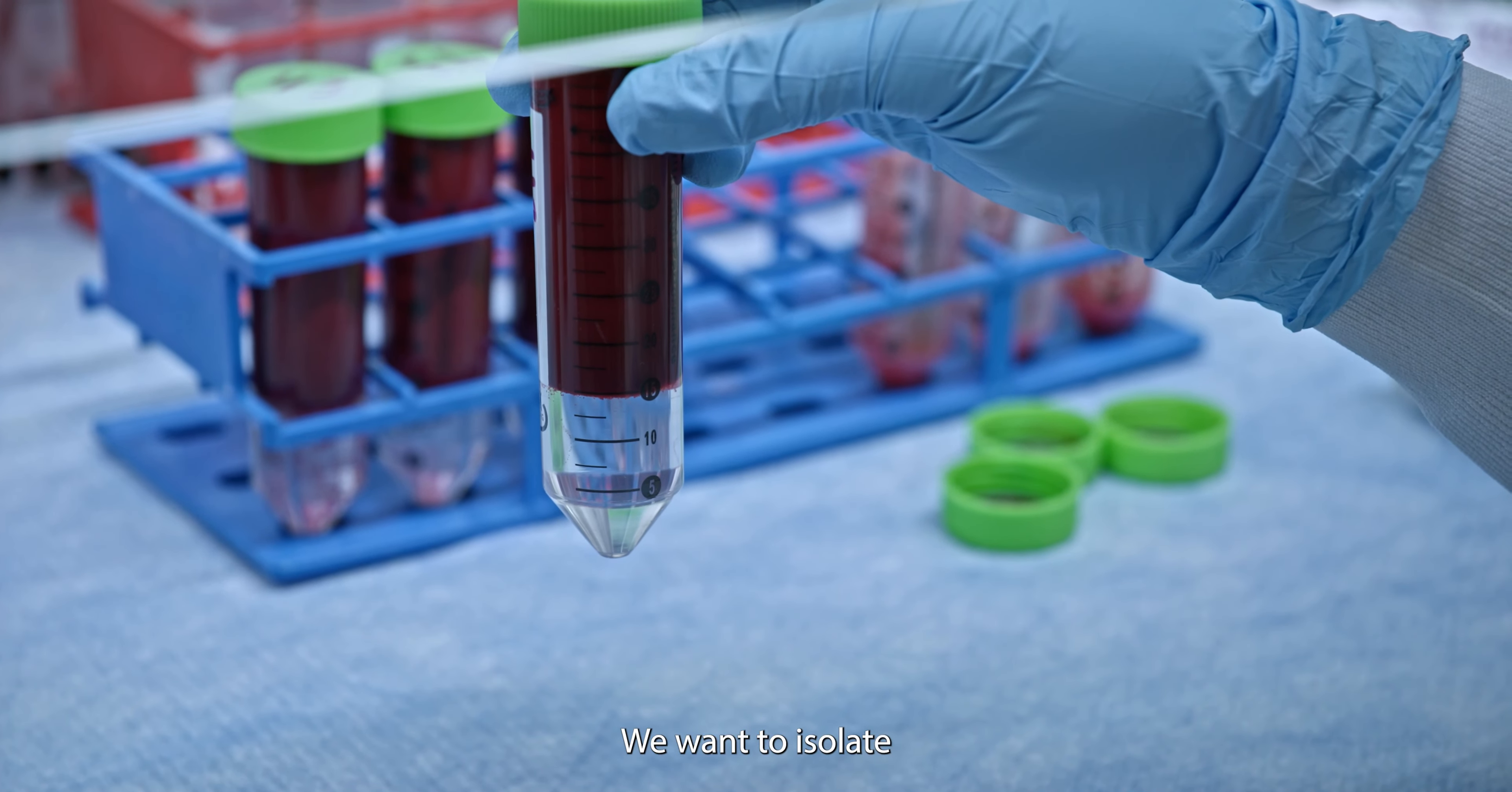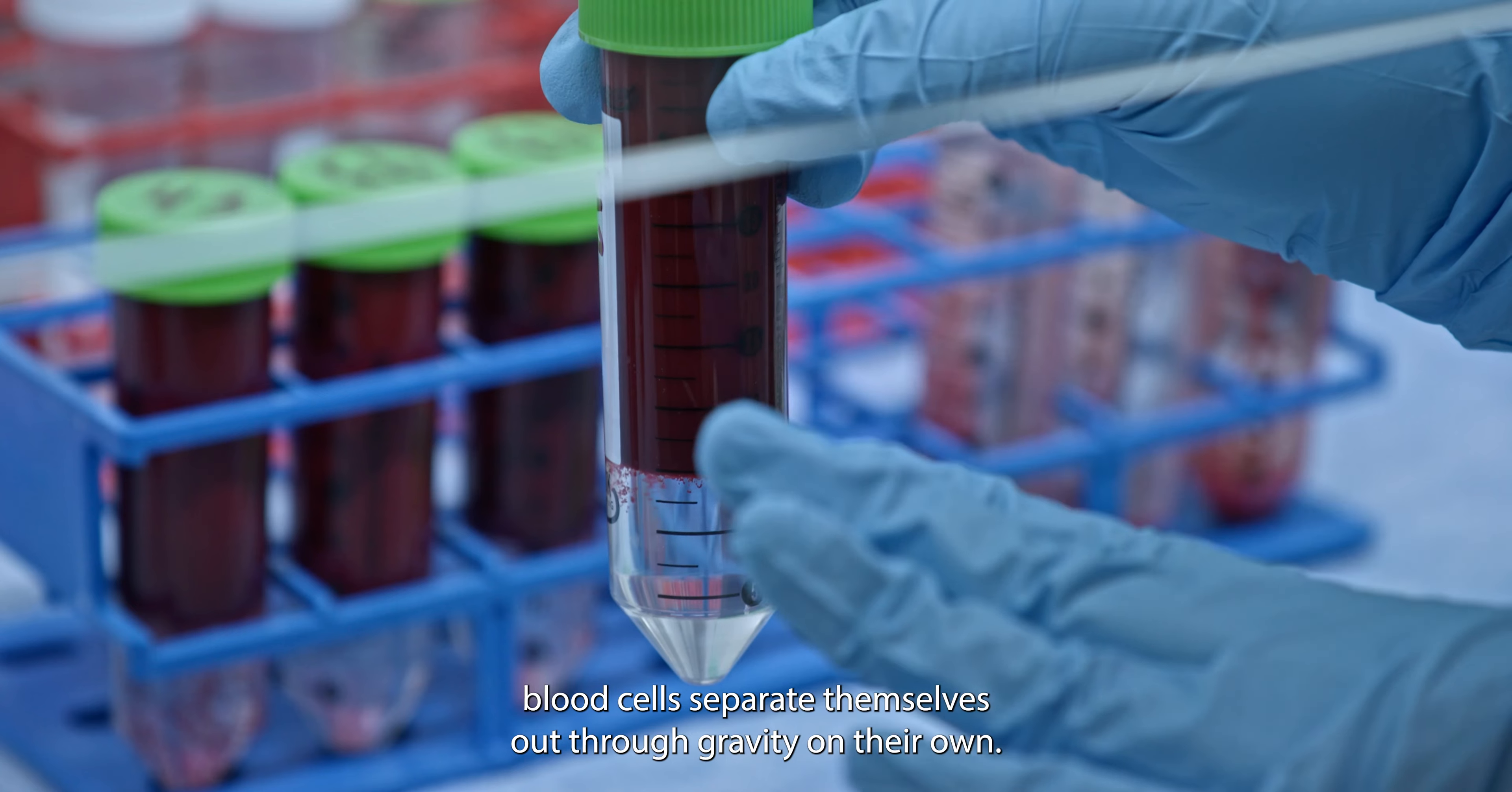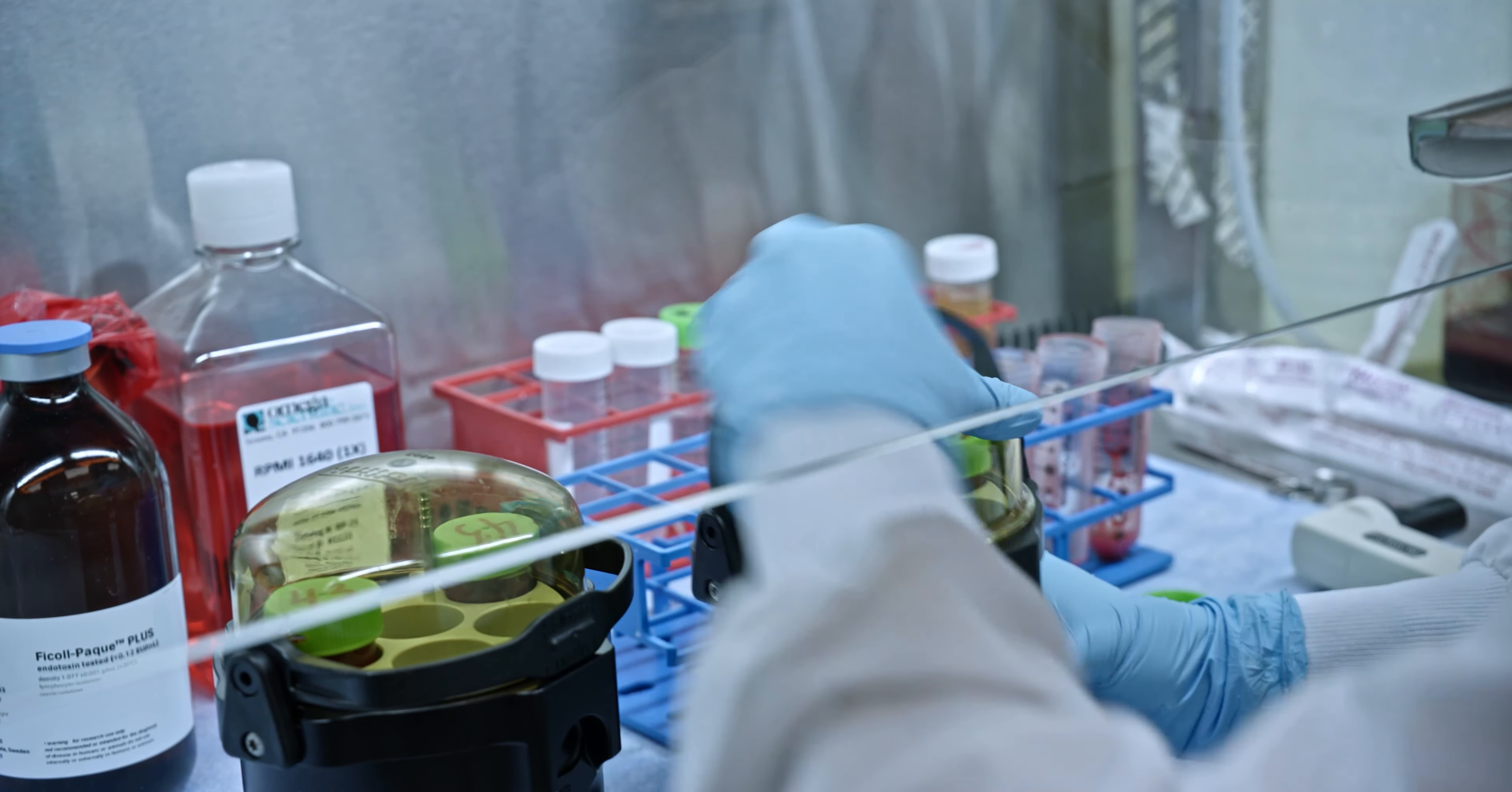We want to isolate the white blood cells from the red blood cells. And with this media, the red blood cells will fall to the bottom and leave the white blood cells above the Ficoll. And the reason we want to gently layer it is so that the red blood cells separate themselves out through gravity on their own. If we broke the Ficoll layer, meaning these two mixed, then the white blood cells will get trapped underneath the Ficoll.